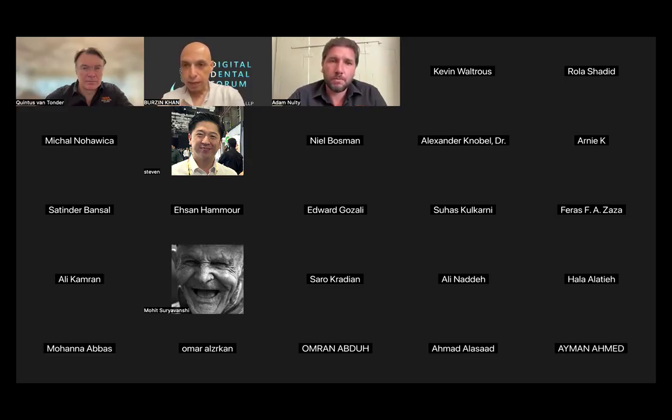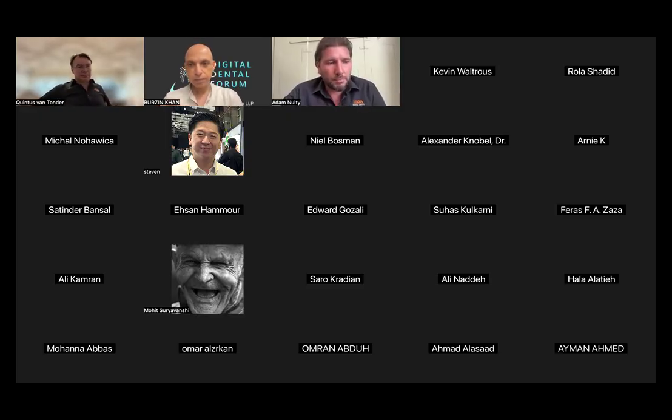There's one more question from Michael, who's asking about the jaw tracking movements which, sorry, the SmartX workflow in Medit has, along with the scan ladder. Yeah, so it's a good question, because a lot of people get confused about the workflow in SmartX. It seems almost backwards sometimes, with the thought process of doing the implant scan first, then the soft tissue, and then the prosthesis. Because some people will think, oh, I've got a pre-op in place, I want to scan that first, so why is that later? Likewise, they might think, oh, I want to scan the soft tissue first.